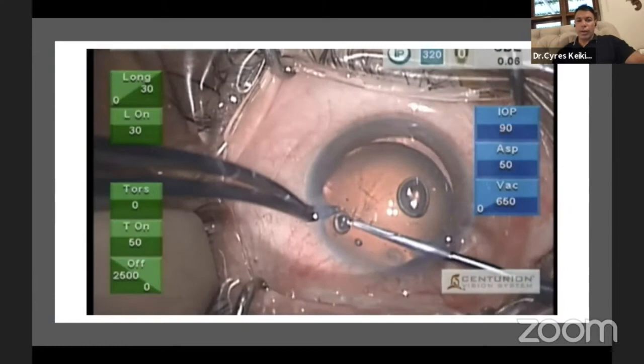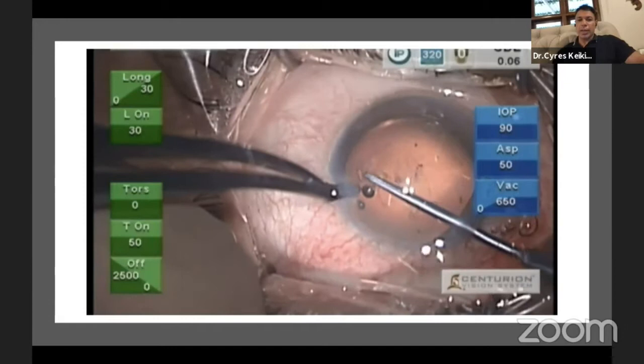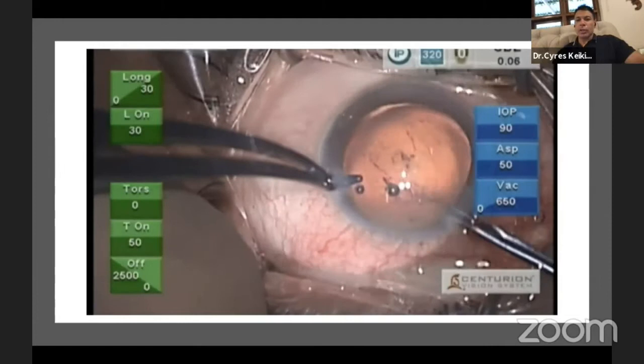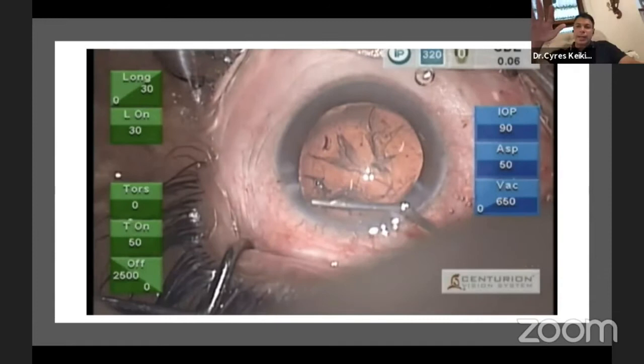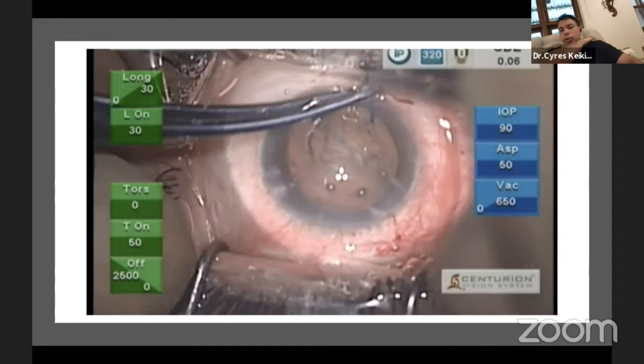This is essentially a blunt trauma with 360-degree zonulopathy — not a 90- or 180-degree loss. I would expect to handle this with a CTR. You need to first make a small rexis, about four and a half to five millimeters, to have a good rim of capsule to hold the whole lens bag up. The entire human lens is luxating into the anterior chamber and tilting, so you do the hydrodissection and see the wave passing across.